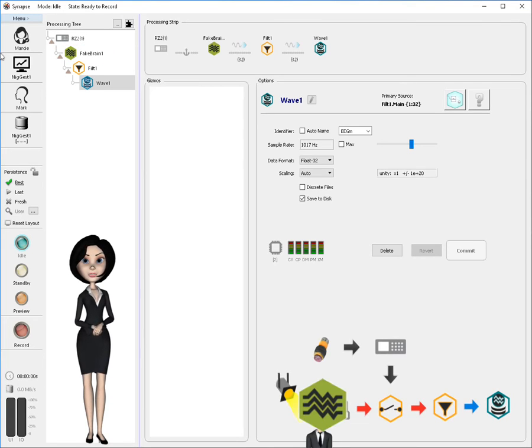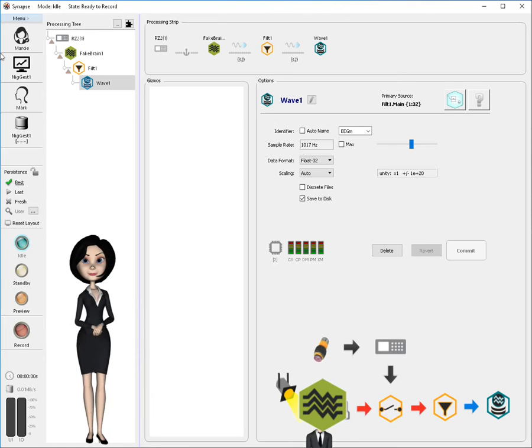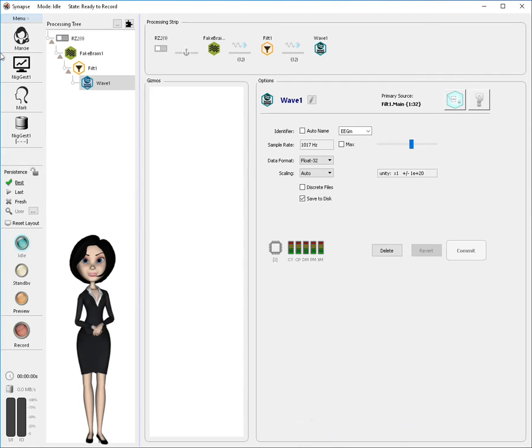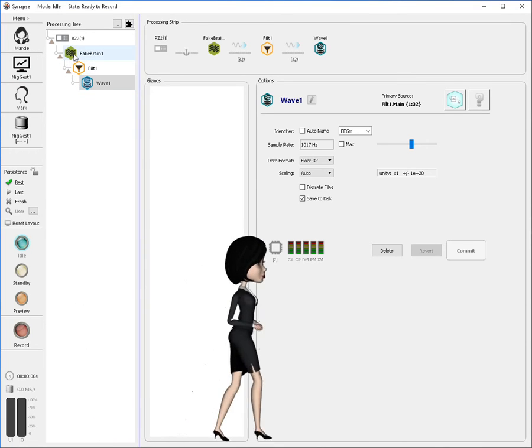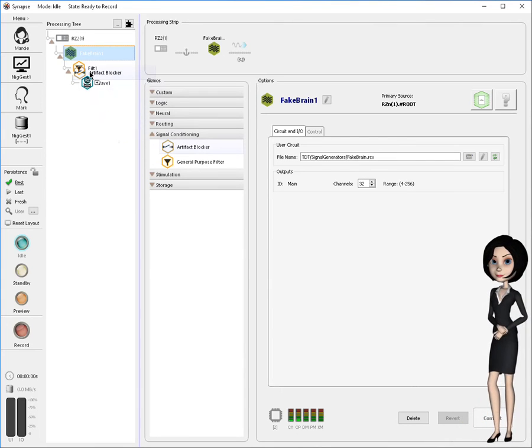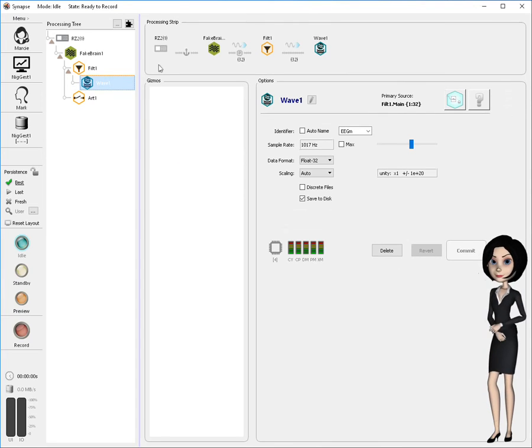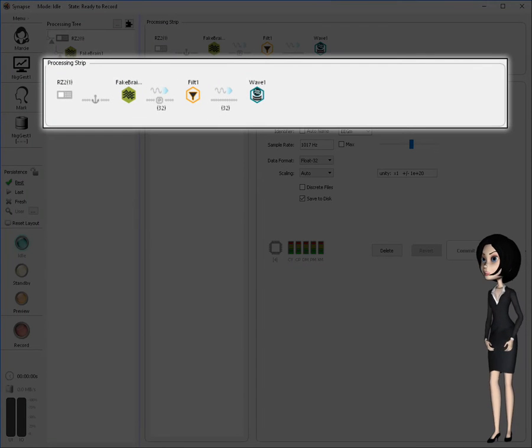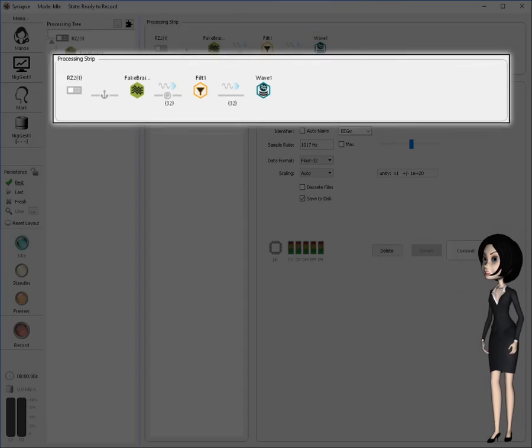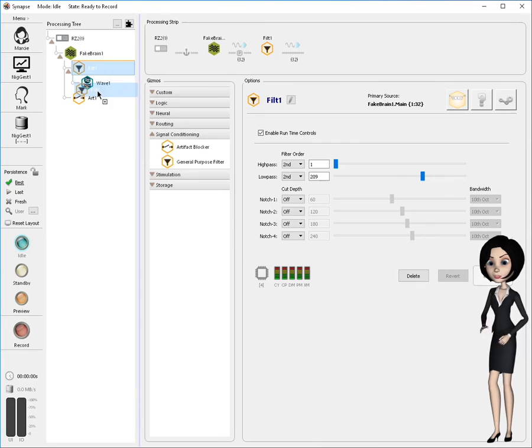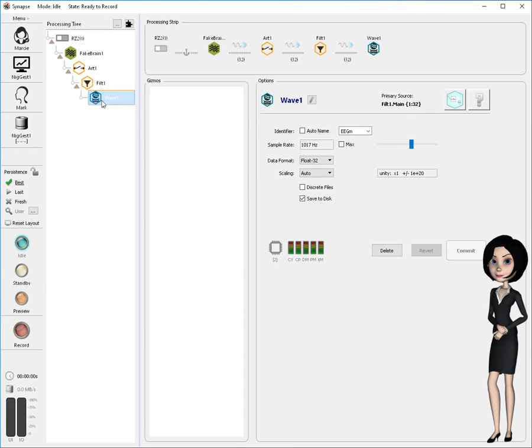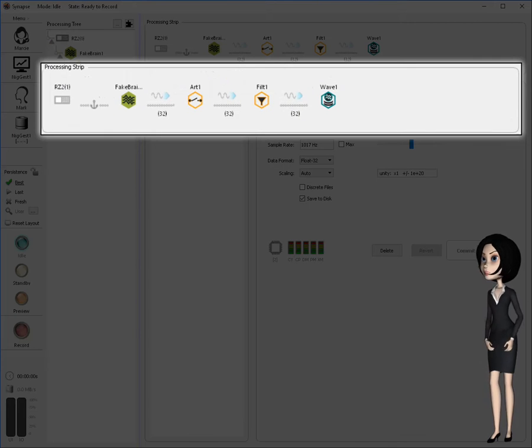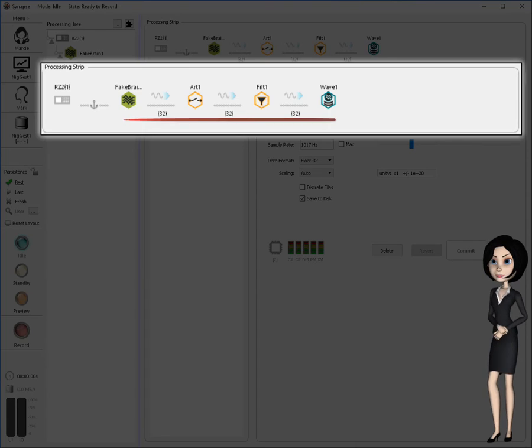We can now modify our experiment to include the artifact rejection gizmo. Also, we will connect its on-off or trigger control to an input signal of the RZ processor. We need to place the artifact blocking gizmo just after the signal source and just before the filter gizmo. So I'll select the fake brain and then add the artifact blocking gizmo into the signal path. Note the filter and stream store gizmos are still not properly ordered. Looking at the processing strip, we can see they are still sourced directly by the fake brain. To rectify this, simply drag the filter gizmo and drop it on the artifact blocking gizmo to properly order the processing. Now a review of the processing strip shows the proper ordering of gizmos in our experiment.